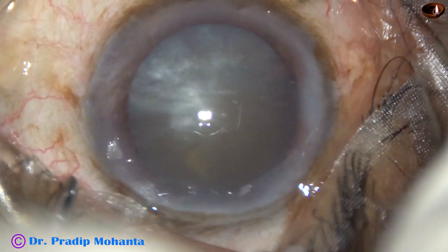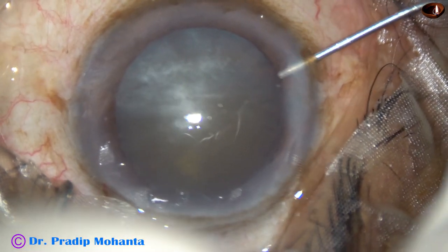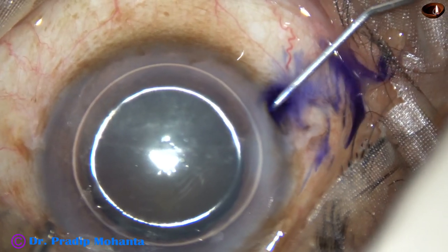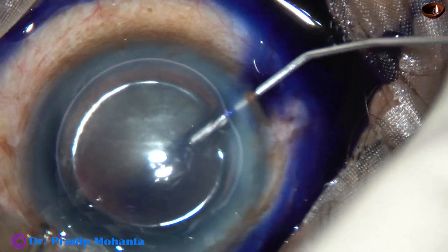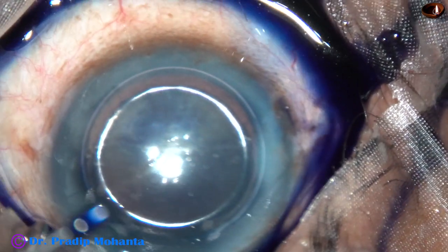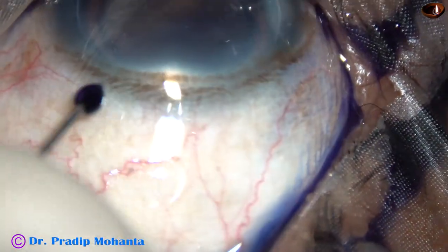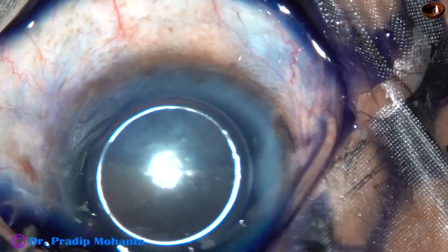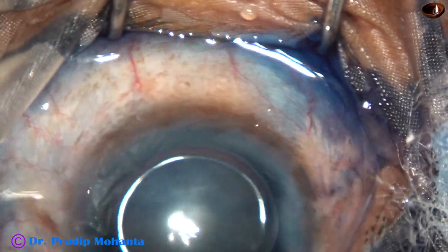These side ports are about 2.5 o'clock away from the main incision. Now an air bubble is injected, and trypan blue dye is applied beneath this air bubble over the anterior lens capsule. Then the dye is washed out with BSS.